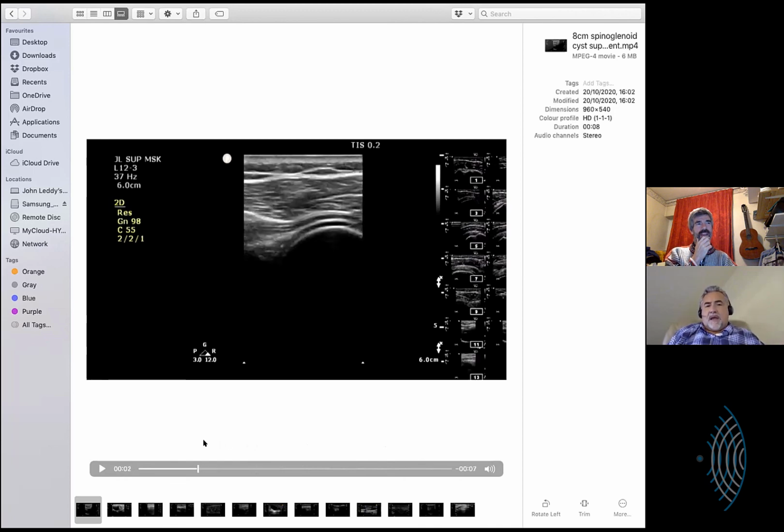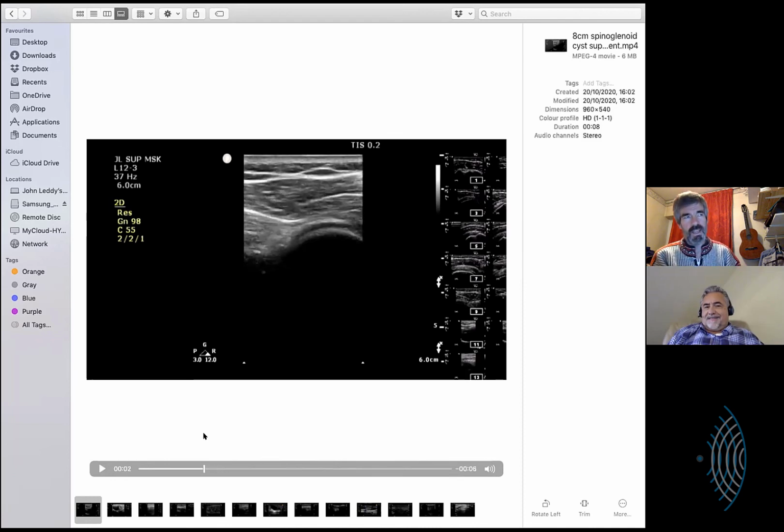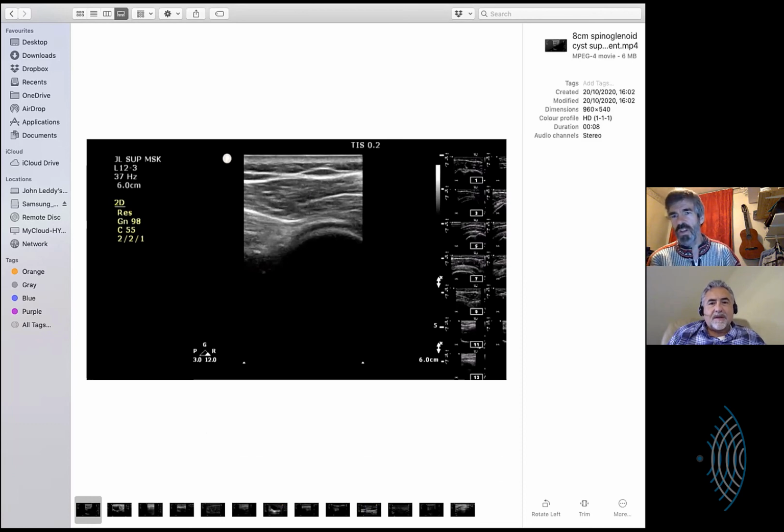Wow. And you have to look back. This is what I tell my students: when you're looking at that posterior view, you're not just scanning the back of the humerus for osteophytes, you scan the glenoid. You scan the glenoid like you scan any joint line. You just scan around it, as far as you can go inferiorly and superiorly, and have a gentle whiz through. You look at the fossa behind there, because that's where you see the cysts.